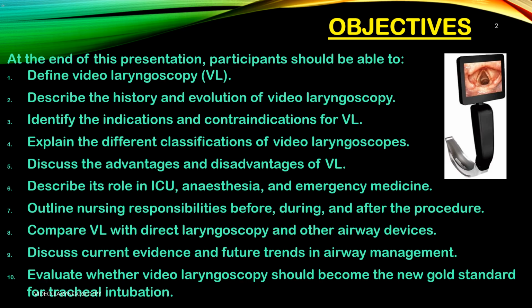4. Explain the different classifications of video laryngoscopes. Understand the types, blades, and how they differ. 5. Discuss the advantages and disadvantages of VL. Weigh the benefits against the limitations. 6. Describe its role in ICU, anesthesia, and emergency medicine. See where VL saves lives across specialties.